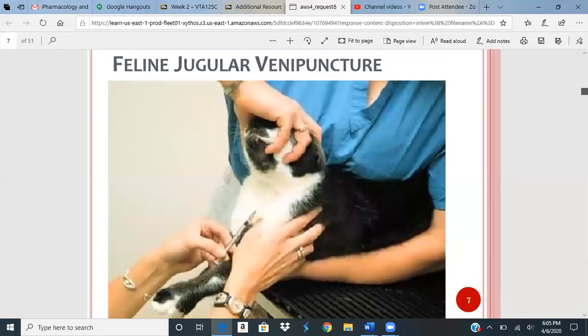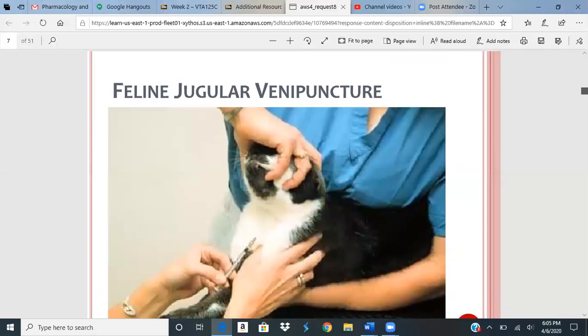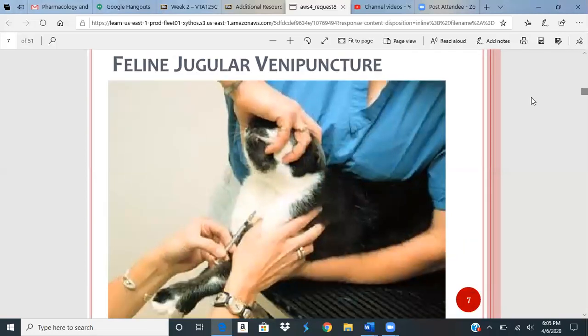All right. Feline jugular venipuncture, that's kind of a wonky way to hold the head from what I told you guys. Mainly you're going to do what works best. This might be okay, only because they're covering the eyes here of the cat. And a lot of times cats do better when you cover their eyes. But we do have better restraint tools for that. We can use a cat muzzle. We have these cat muzzles. I'll have to show you guys.